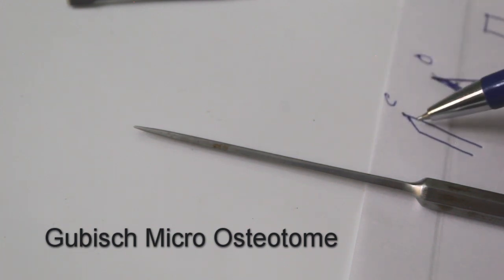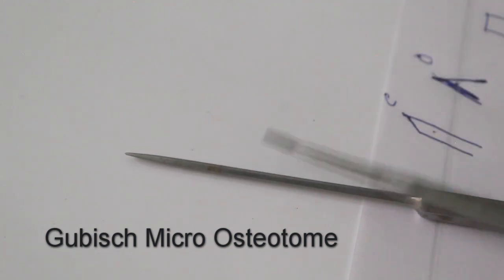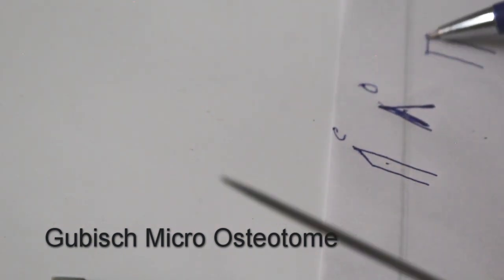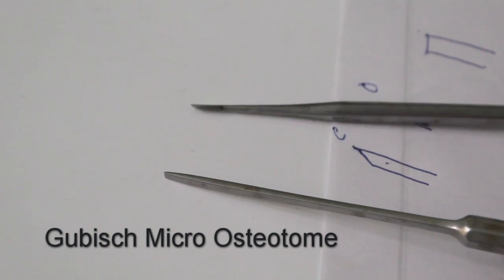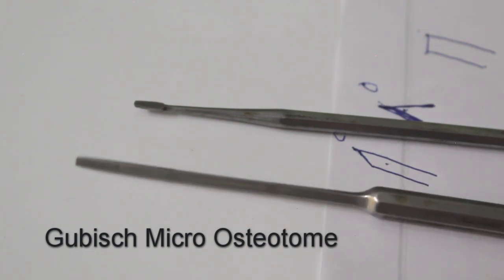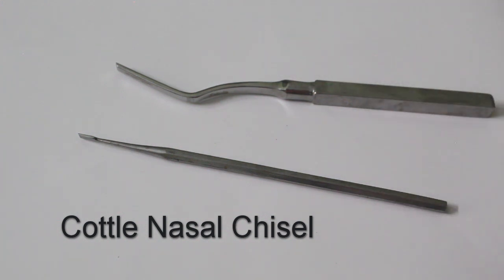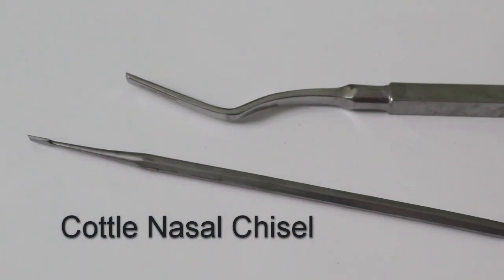Whereas for a chisel — this is a Cottle chisel — the end is beveled on one side only. You should look at the tip carefully to distinguish them. The chisel provides an extremely flat cutting edge, and the set osteotomy level is continuously retained, leading to very precise detachment. The chisel can be straight or curved; in either case, identify it by looking at the tip. Both types shown here are chisels.